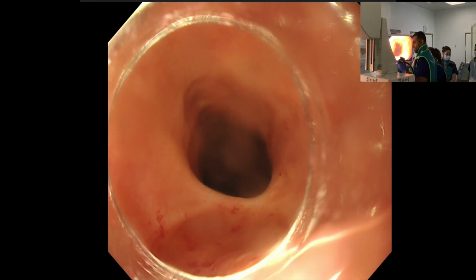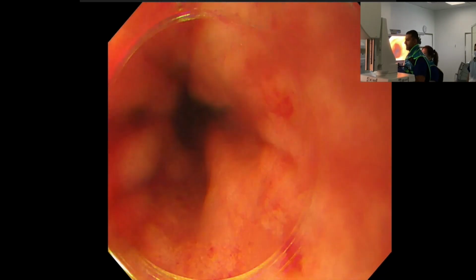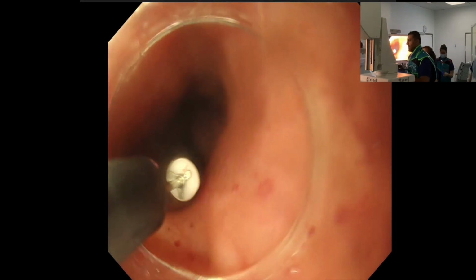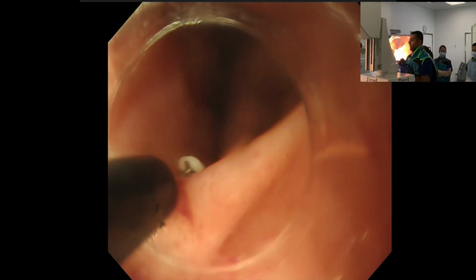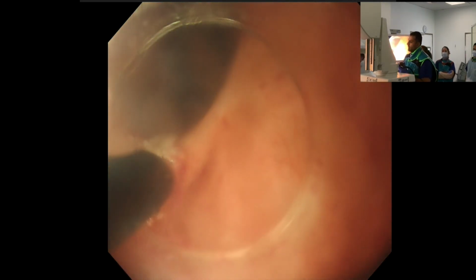These fibrotic, simple strictures where there's almost a ridge will not respond to mechanical dilation with balloons, and because there's fibrous scar tissue there, what you want to do is to actually cut away that scar with a needle knife. So I've got a conical cap on here just to help stabilize the distal tip of my endoscope. Knife out, please. I've got the IT nano knife here made by Olympus Endosurgery. And what we're going to do is basically like one would do for an ESD or a POEM mucosotomy, just cut away this ridge and expose the muscle fibers.